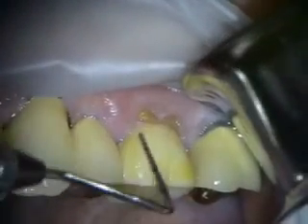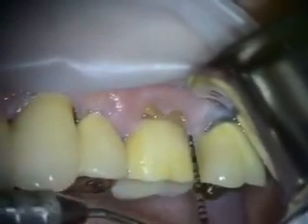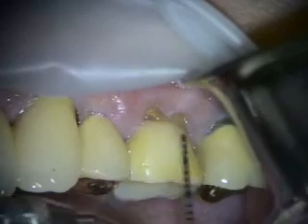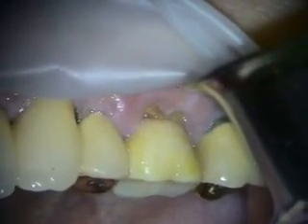Today we're removing number 14. It's a non-restorable tooth, and if the socket is cooperating, then we'll put in an immediate max implant.